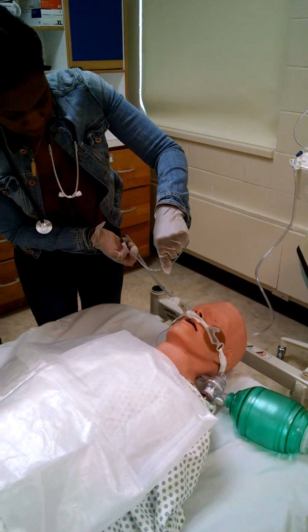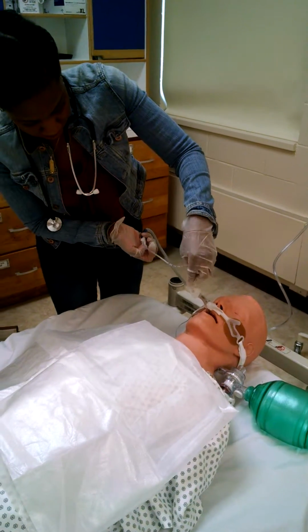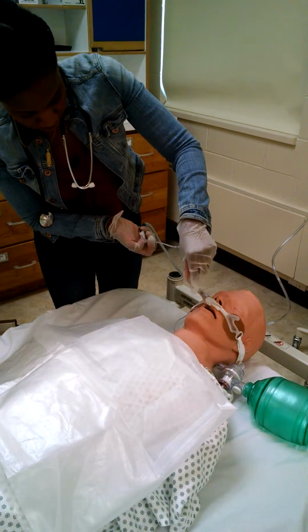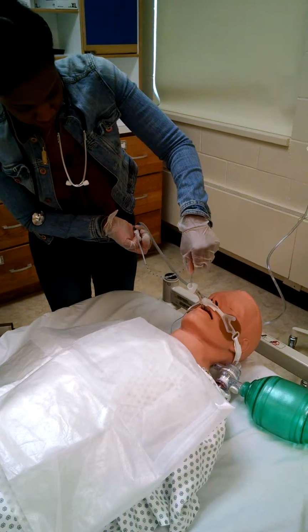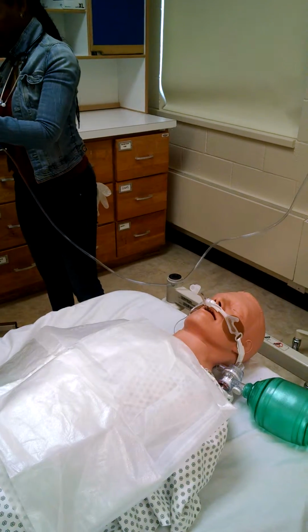And once again, I'm going to suction. Okay. Put my thumb on the thumb port when I pull out.